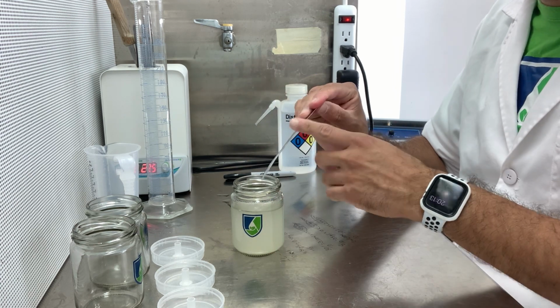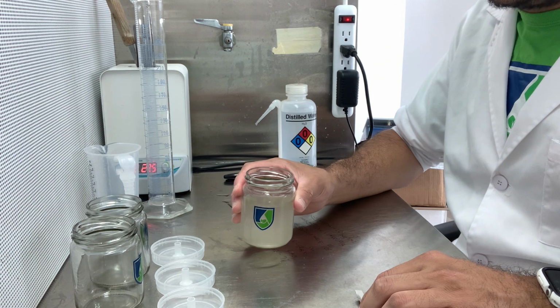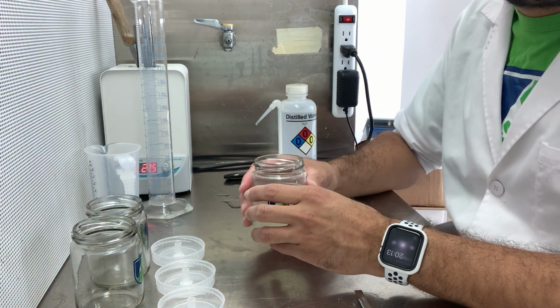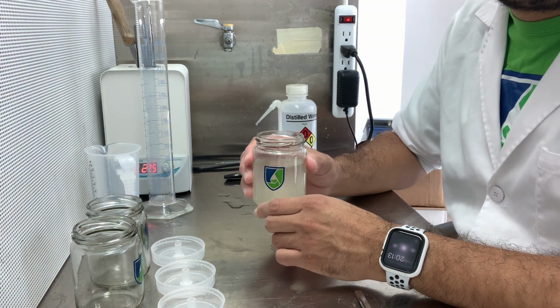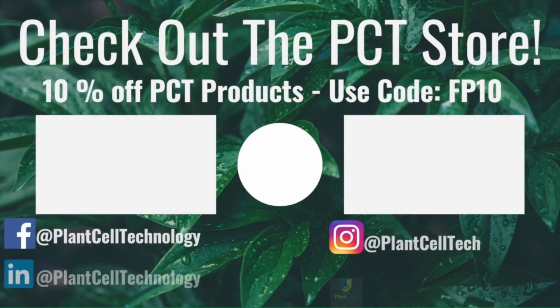Because it's a very small amount, and putting this on the stove probably is going to be a waste of resources, I'm just going to take this to the microwave and get it to boil, and then I'll be back.